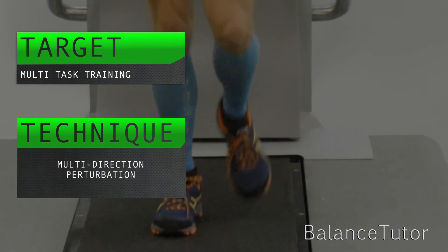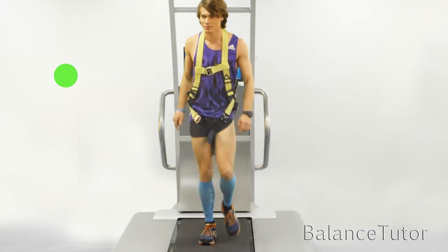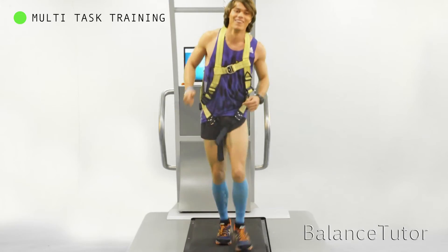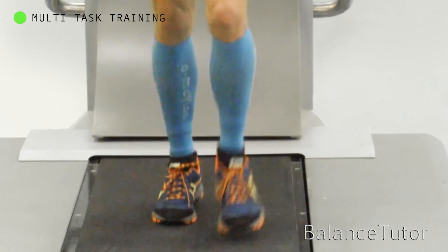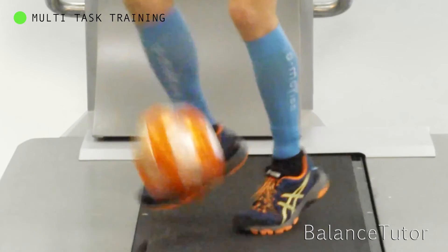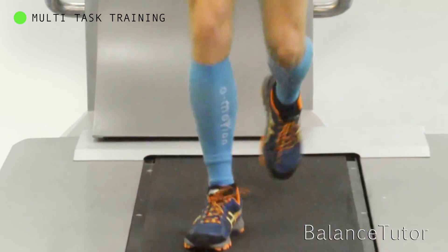This exercise targets multi-task training by using multi-direction perturbation. This is highly beneficial for neuromuscular coordination and multi-joint stabilization.